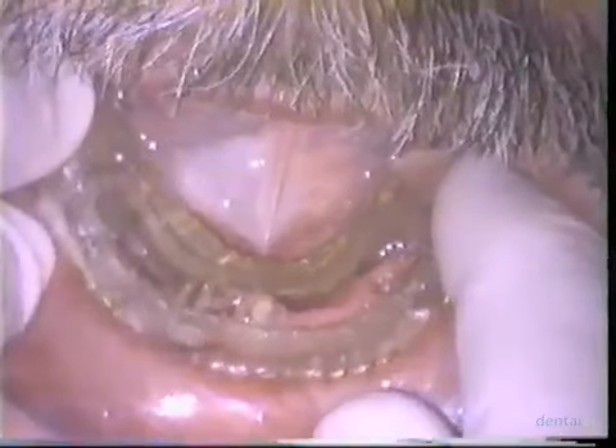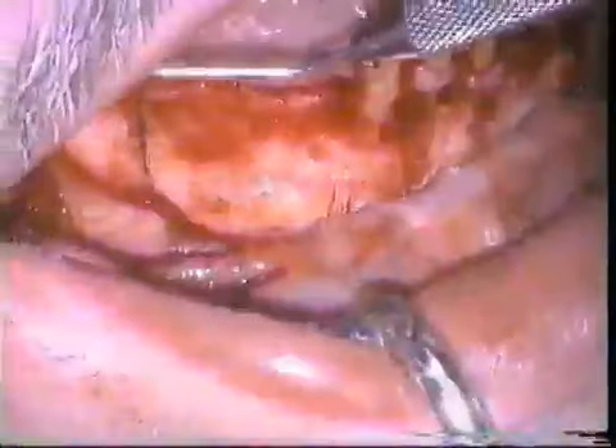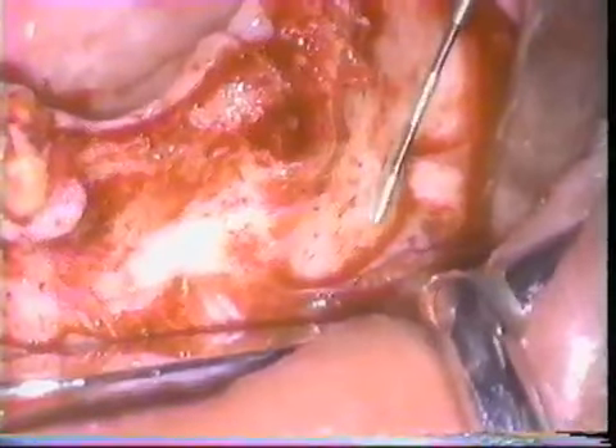We test out the surgical stent. We can now go in and reflect the flap and expose the surgical area. As you see here, identify the position of the mental foramen on either side. And we're going to place our implants between the mental foramen anteriorly and if possible, even get some implants posteriorly. We want to see the distance from the mental foramen to the occlusal section of the ridge or the crestal region. We extract the anterior hopeless teeth and flatten out the ridge to create an acceptable bed recipient site.